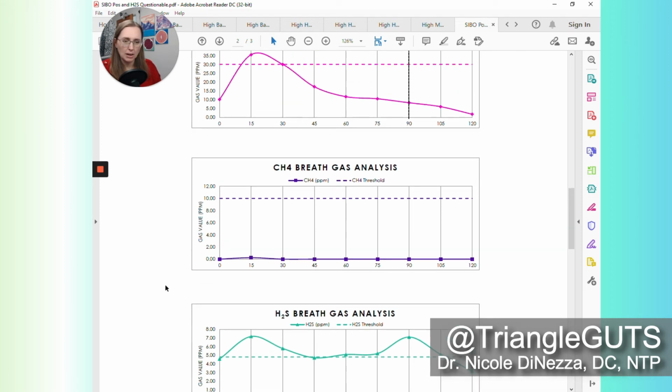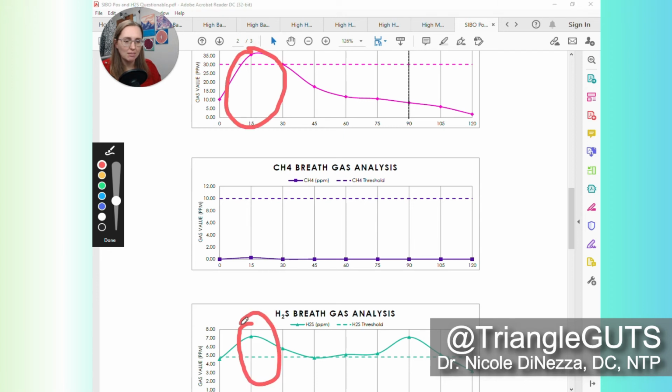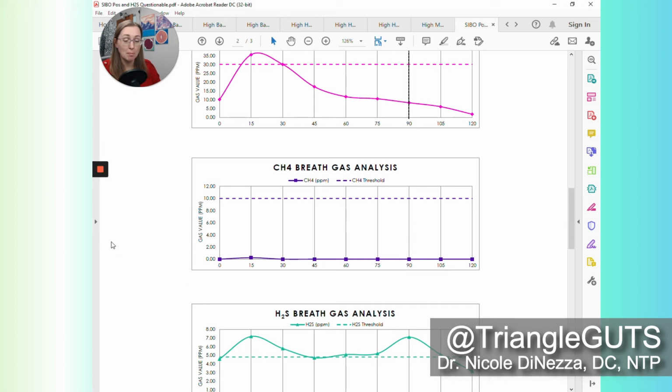But I will also point out, look at the graphs and tell me what you notice. Well, you can't because I'm recording a video. Notice that the peak for hydrogen actually correlates with the peak for hydrogen sulfide. So what we used to think of like, oh, if we have a flat line hydrogen, then that will correlate with the hydrogen sulfide production because the hydrogen sulfide producers are consuming the hydrogen. At least for this person, the two peaks actually correlated with one another. So I don't really think that the flatline SIBO breath test can tell us as much about hydrogen sulfide as we might have thought it could.